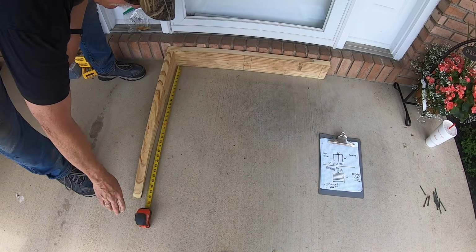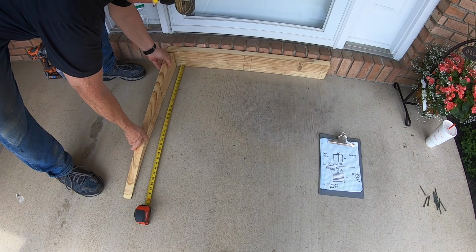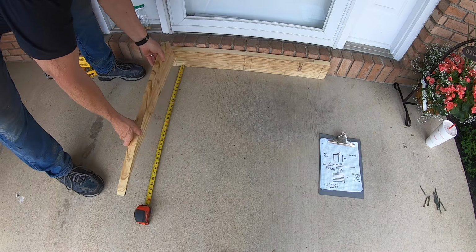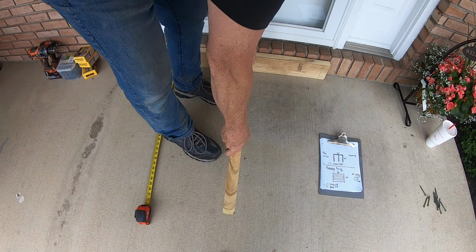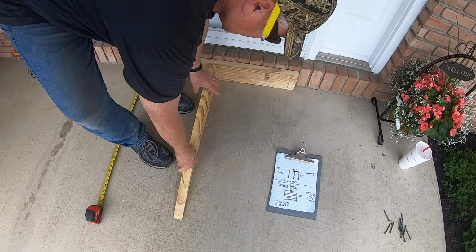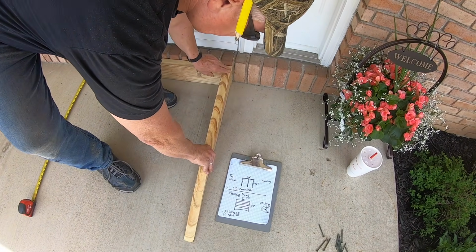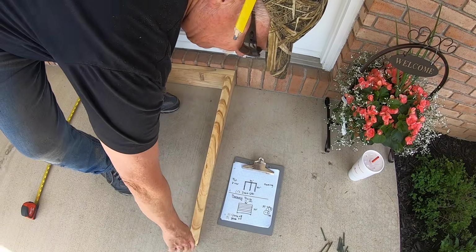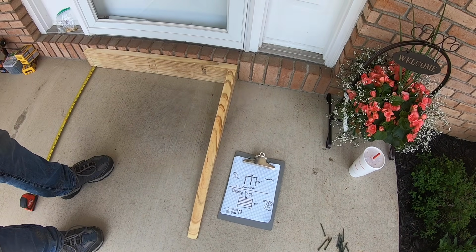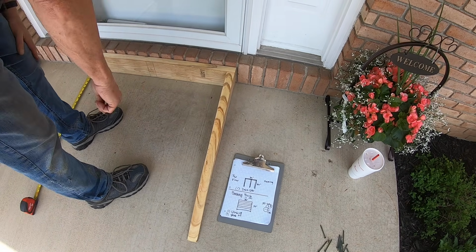So one of the things you may want to do, before you make any other cuts, is make sure it actually is going to fit against your header properly. And that right there looks really good. So we're going to go ahead and move it to the center one, because we may use this as our template. Then we'll move it to the last one after we check to make sure that looks good. And there's the last one right there, and all those look good. So that's going to be our template. You want it flat all the way around and come down at a pretty sharp angle at the end, so it can easily be able to get a wheelchair up there.